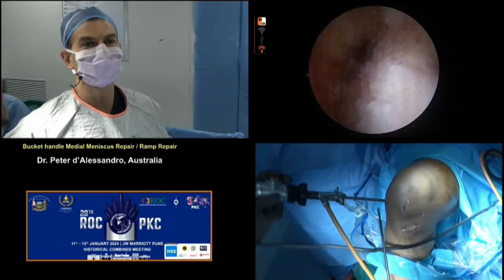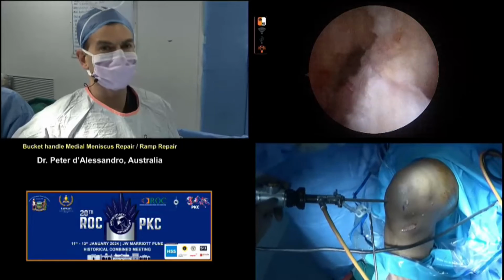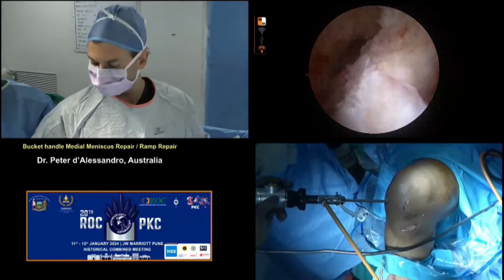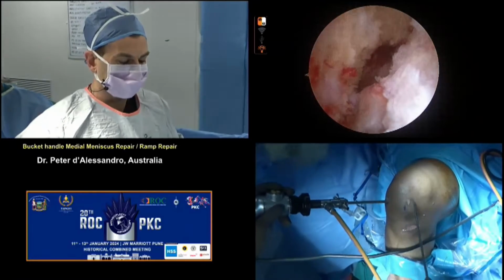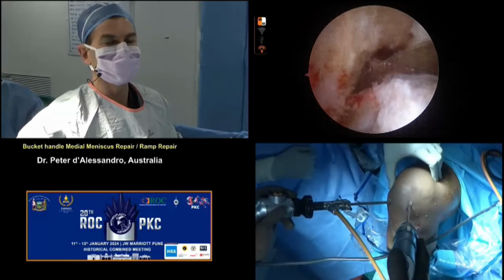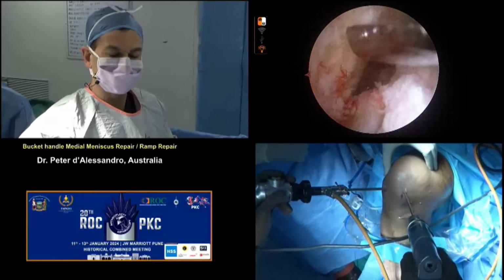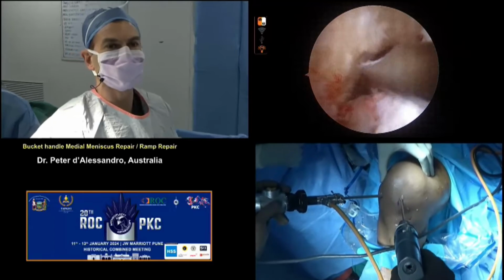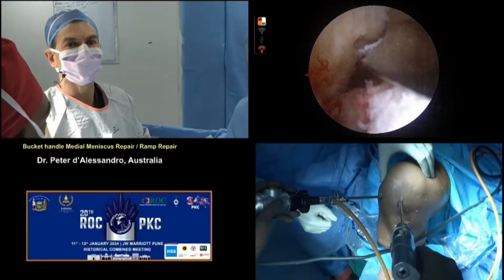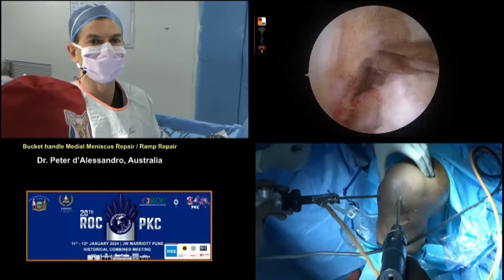Any consideration of doing your meniscus first, or medial side, lateral side, ACL? What is your thought process? Yeah, I think that's a great question, and something that's evolved as my career has gone on. We've often been told, do the menisci first. The menisci are going to be challenging here. I don't want to be hyperflexing the knee once we're done, so I'm actually going to drill my tunnels. Then we're going to go to our menisci, pie crust. We're going to do the medial side, and then the most difficult, the lateral side.